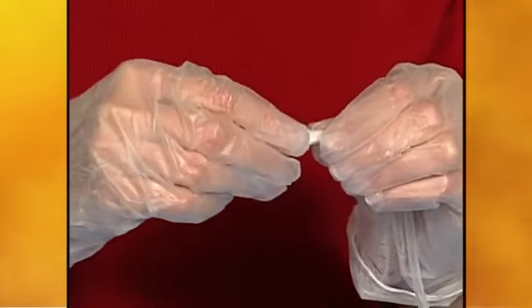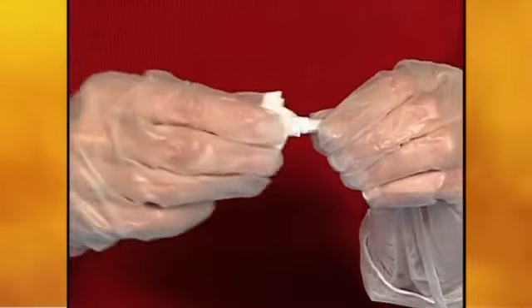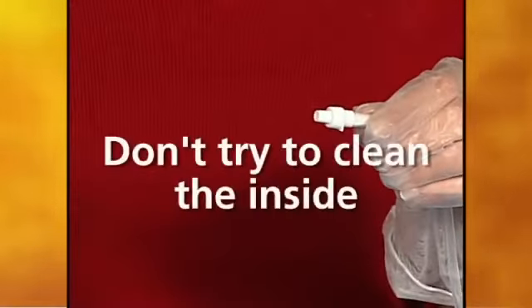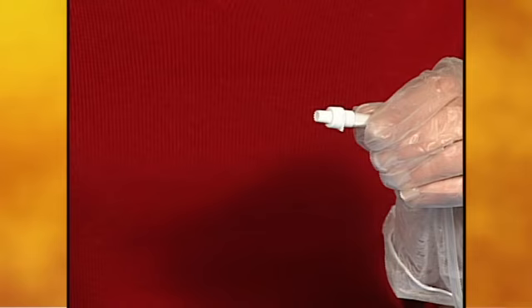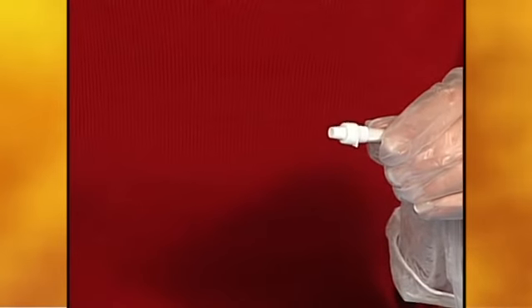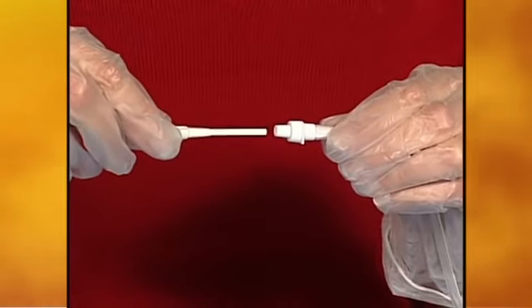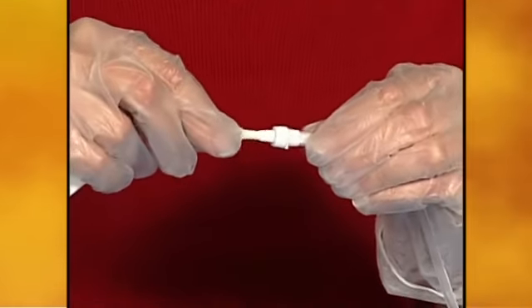Holding the catheter near the end, remove the cap from the end of the catheter. An alcohol pad should be used to clean only around the opening. Putting anything inside the end of the catheter could damage the valve and allow air to enter or fluid to leak out. While holding the catheter, pick up the drainage line near the tip and insert the tip into the end of the catheter. When securely connected, a click should be heard and felt.